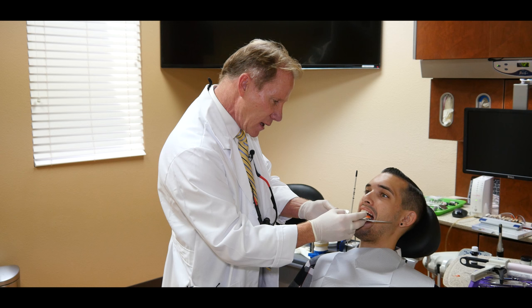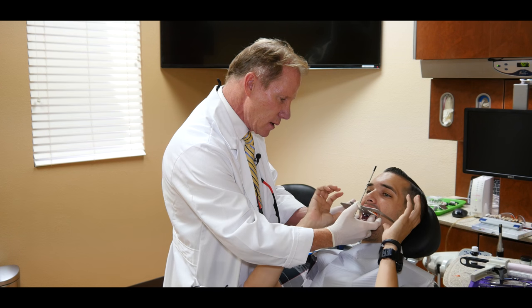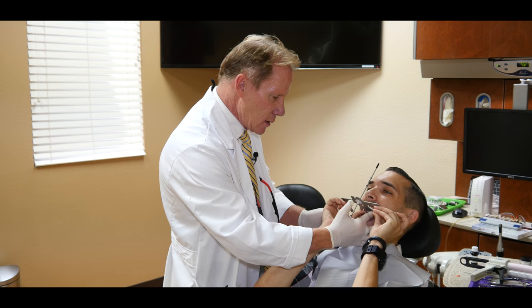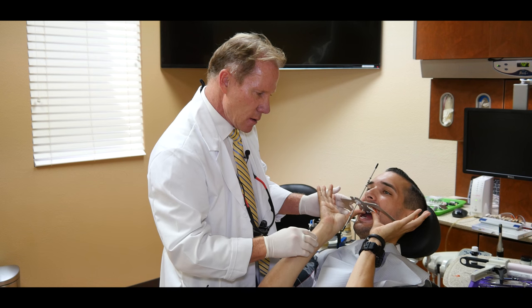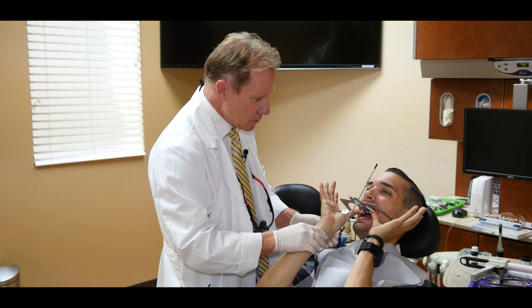So I'm going to put this back in. Jake, I'm going to have you go ahead and hold it. Why don't you take your thumbs and hold right here, if you can. Right, perfect. You've got to make sure it's seated. All right, so let's walk over and I'm going to take a photograph of you against this dark background, okay?